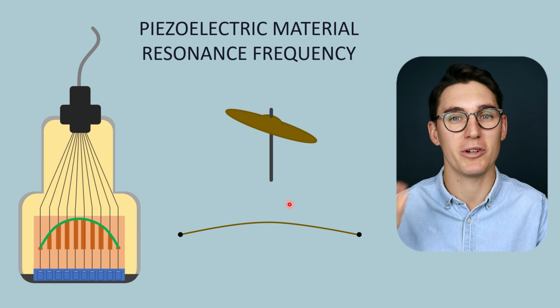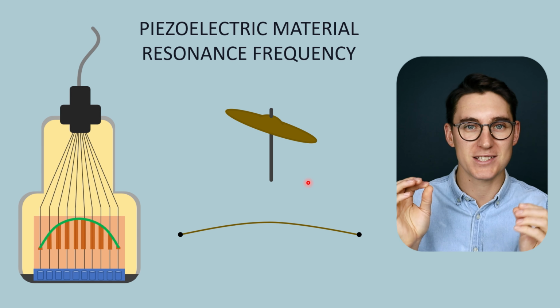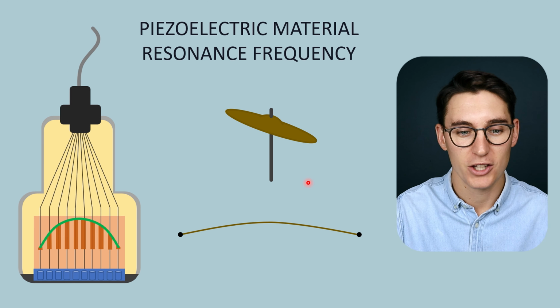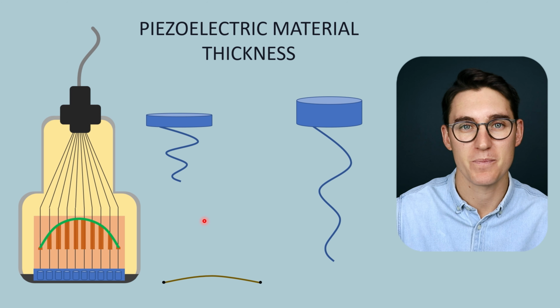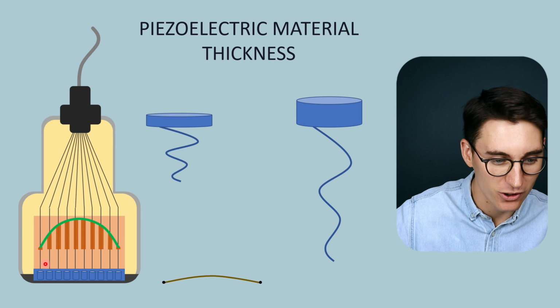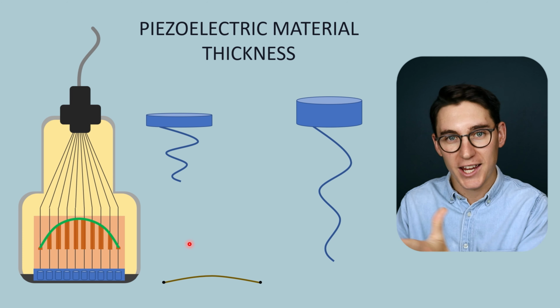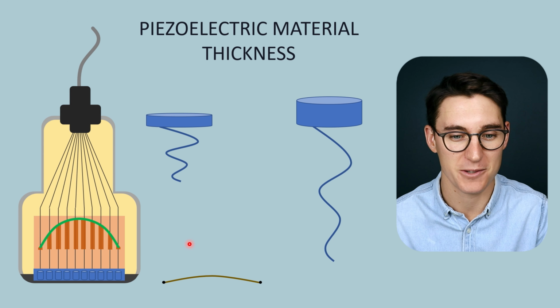In part 2, where we look at the damping block, we're going to think of it as being a cymbal. Both have the same concepts. They resonate at a set frequency when a force is applied to them. So let's have a look at the individual units here, our PZT crystals. Now we've got multiple transducer units making up the end of our transducer here. In pulse echo ultrasonography, we want multiple different units in order to get lateral resolution within our image, a concept we're going to look at later.